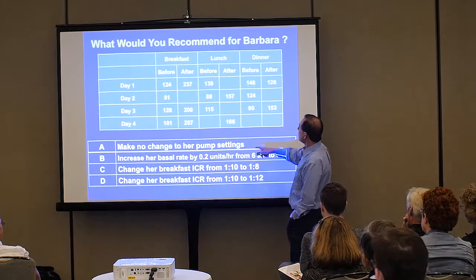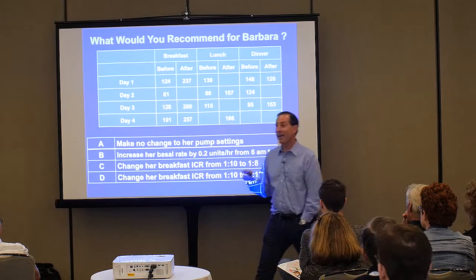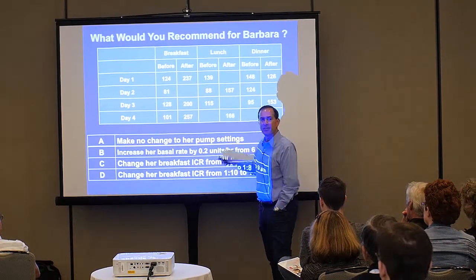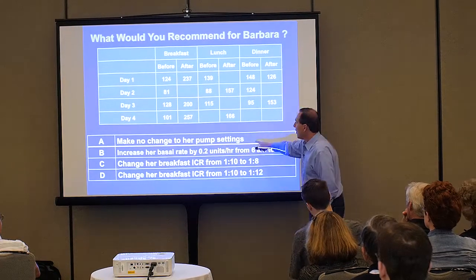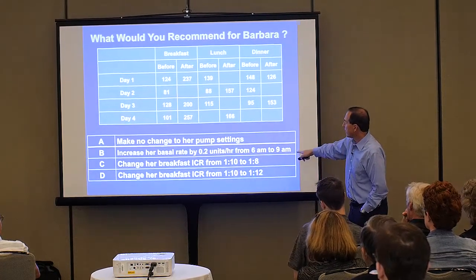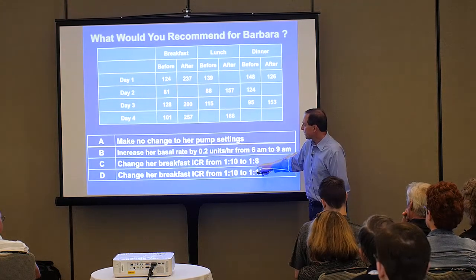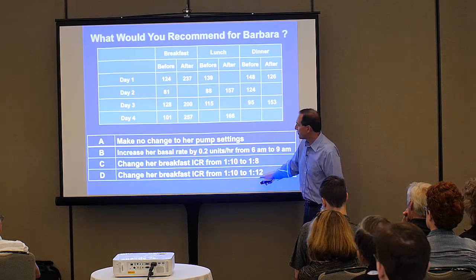Are you going to tell her, you know, Barbara, you're doing okay, we'll just leave things status quo? And by the way, not to insult my colleagues, that's what most doctors tend to do: you're fine. That's not the way I like to practice, I don't think that's right. Do you want to increase her basal rate from 6 a.m. to 9 a.m.? Do you want to strengthen her carb counting ratio at breakfast, or do you want to weaken her carb counting ratio at breakfast?